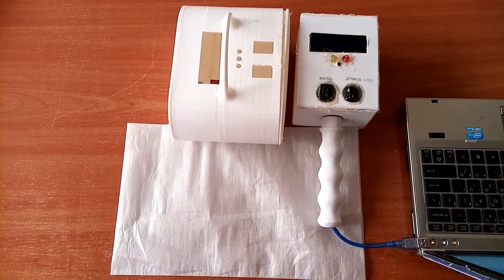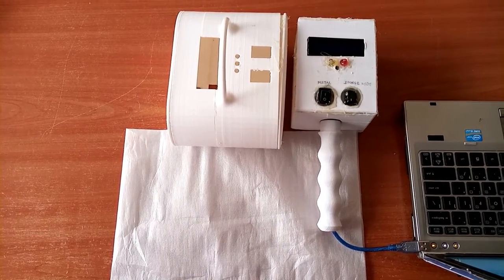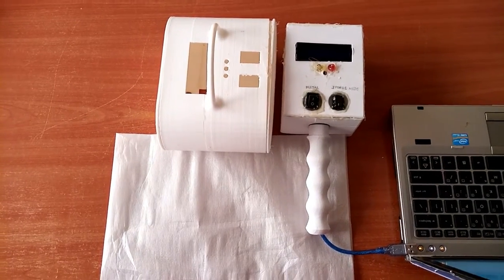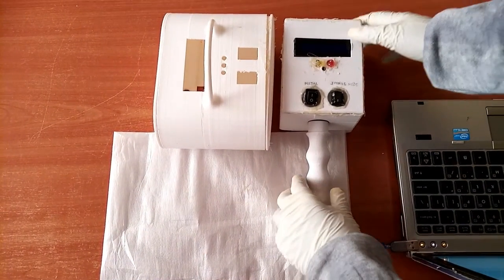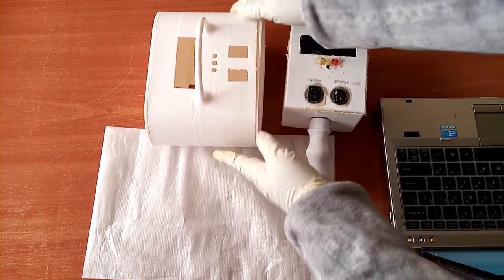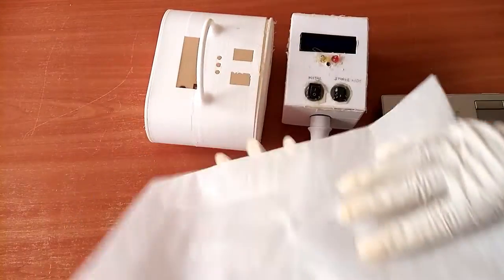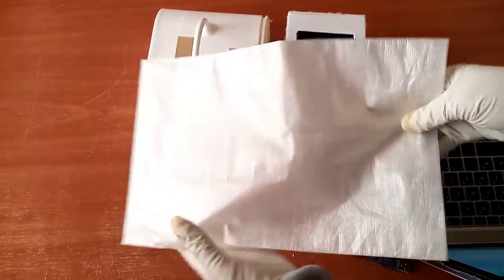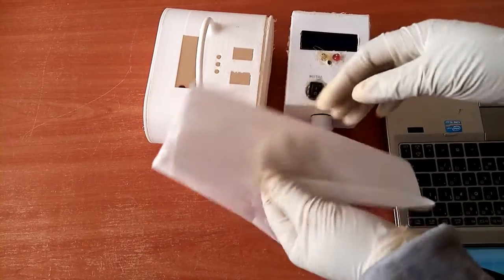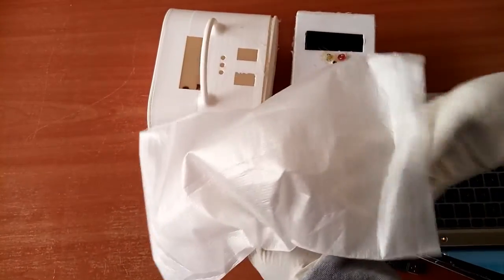First, I'll start with introducing the casing of our device. It ensures that there's no infection transfer from one patient to another. So here is the inner casing, and this one is the outer casing. So for the inner casing, we'll have this disposable sterile cover. We didn't get one, but we'll use this one for demonstration. So this paper, the device is put inside here before the procedure, and then after the procedure it's disposed.